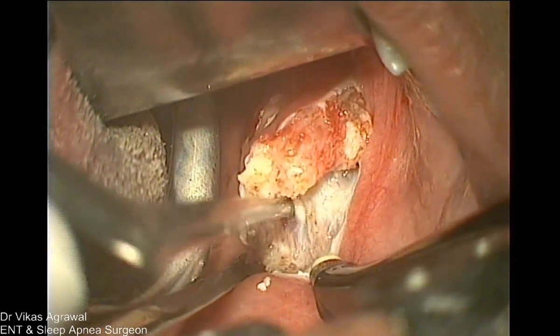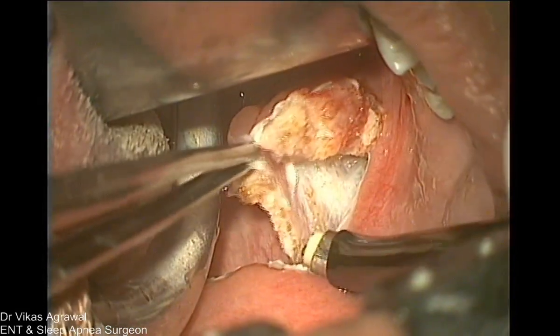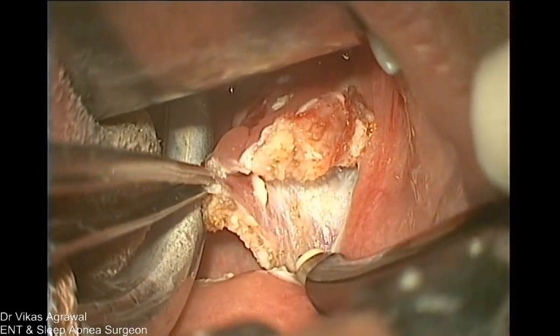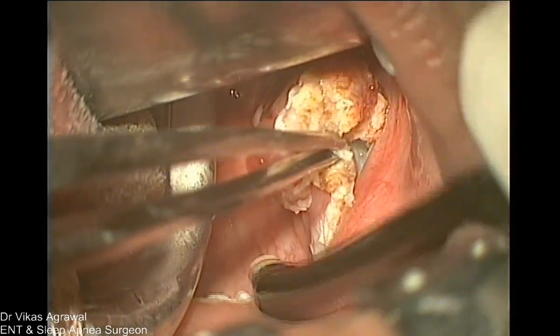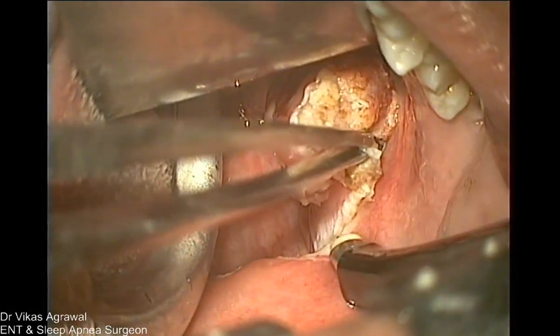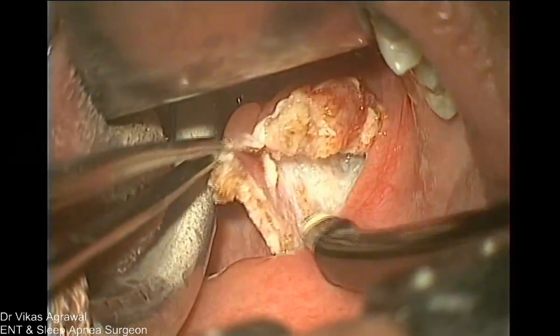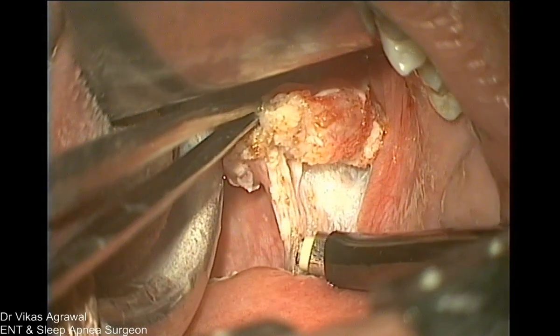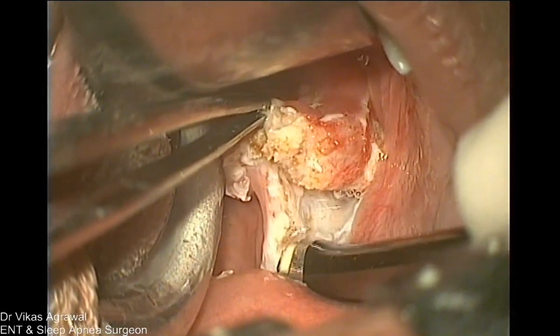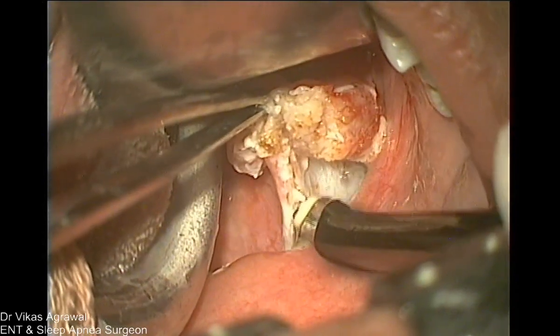Now whether you suture this here, which many people do, or you cut it. So unless you take this incision onto the, see this, these are all muscles, the oblique fibers, you'll not get a complete opening of this area. So you can suture this like this, or you can suture it like this, whatever ways, or you remove it. I prefer removing it, so that there's no ambiguity on it falling back again.